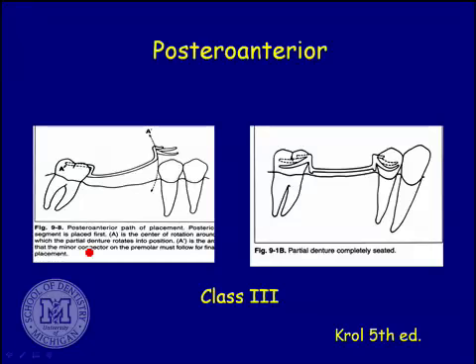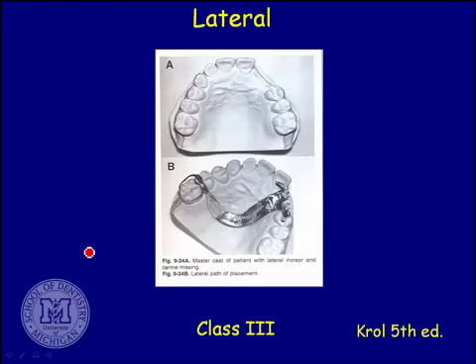We've got back to front. And that's the same one that's sort of shown on the cover, that you seat the back first and then you rock it to the front. So you either got back to front or front to back, and sometimes you can have a lateral path. So you've got some teeth missing right here, so you're missing basically a lateral incisor and a cuspid. And instead of doing a fixed partial denture there, it's thought, okay, can we fit a partial denture framework in there, and then basically let this part seat down first, and then arc or rock the partial denture down to get a clasp to engage over here.